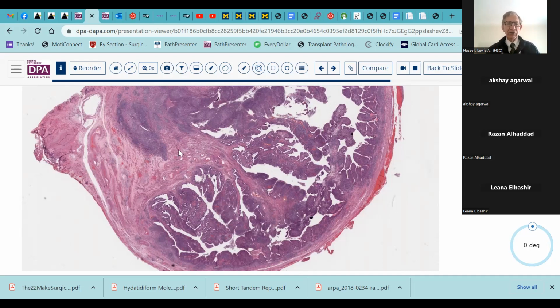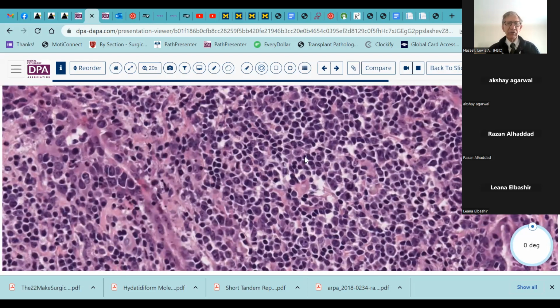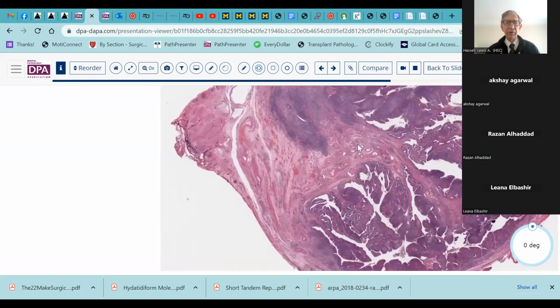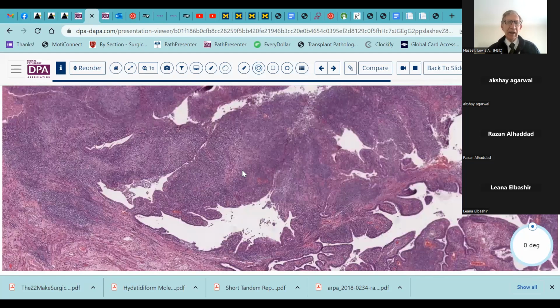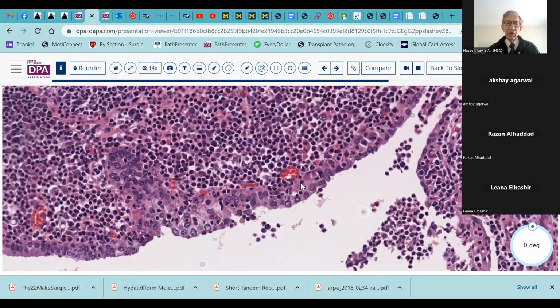Now, the other thing to notice here at low magnification is there's a lot of blue tissue here. And I think you can see that we have some pretty intense lymphoid inflammation here, a mixture of inflammatory cells here, some vessels, maybe a plasma cell or two as well. And there's a little bit of perivascular clustering. So lymphoma might even be a consideration, along with the more typical inflammatory lesions. And here you can see in these epithelial lined spaces and around the lumen that you also have a dense inflammatory process here. And as well, you can see that there is exocytosis of lymphoid cells out into the epithelial compartment and beyond into the lumen.